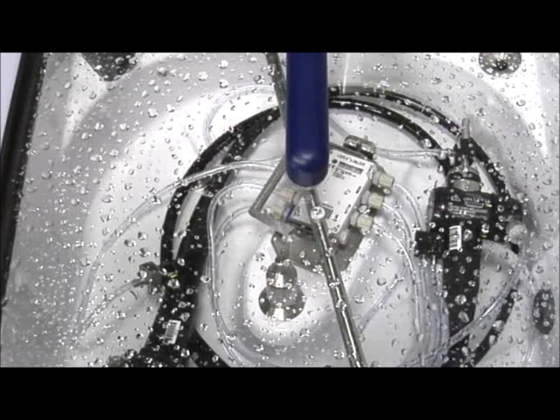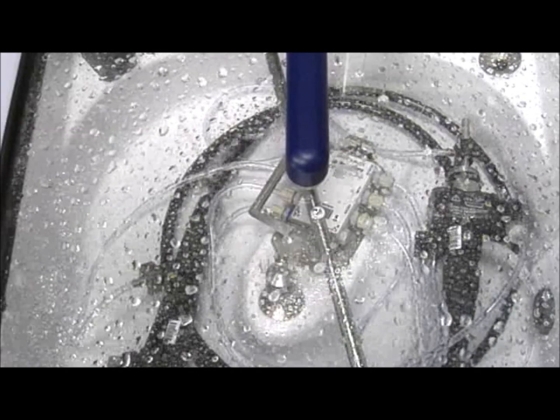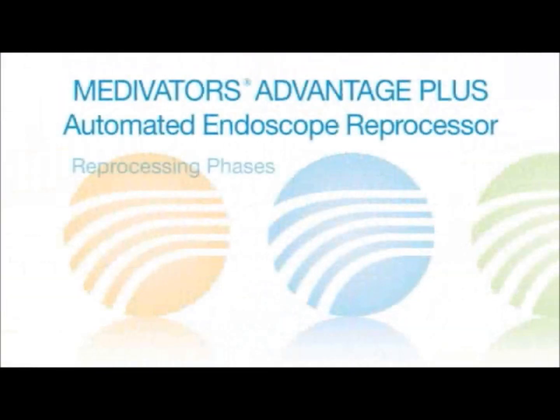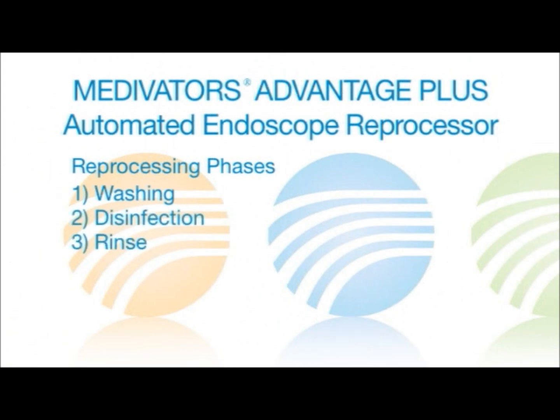The duration of the Advantage Plus cycle depends on the parameters that have been entered and the reprocessing phases chosen. The phases include the washing phase, disinfection phase, rinse phase, alcohol purge phase, and air purge phase.